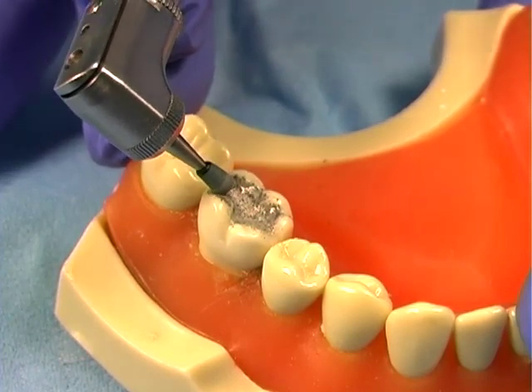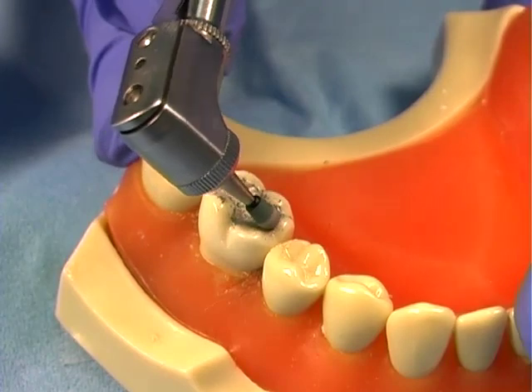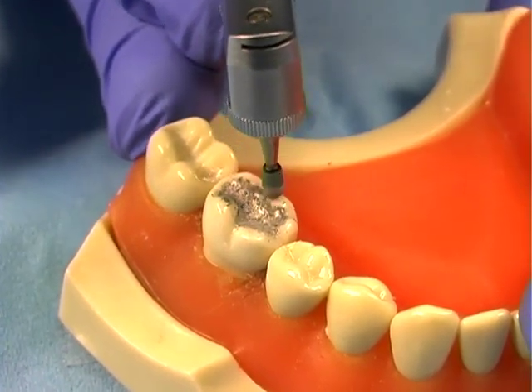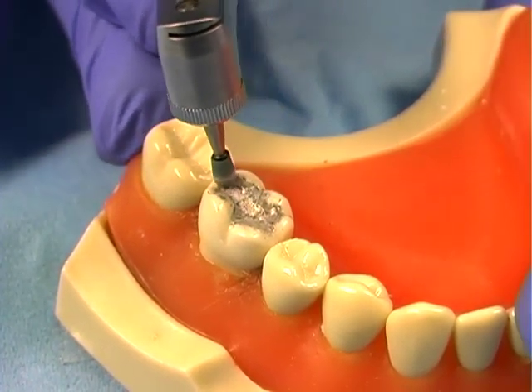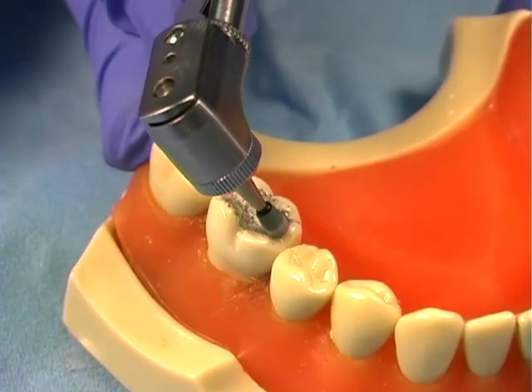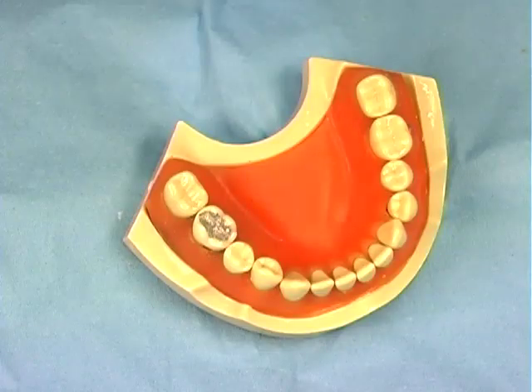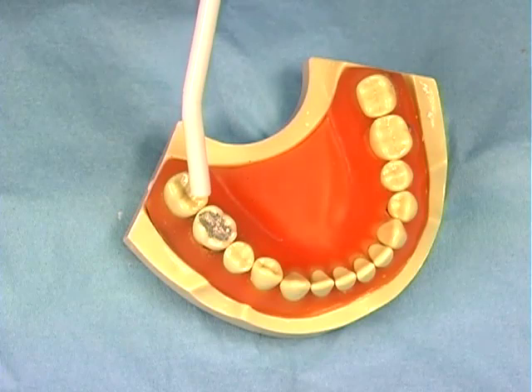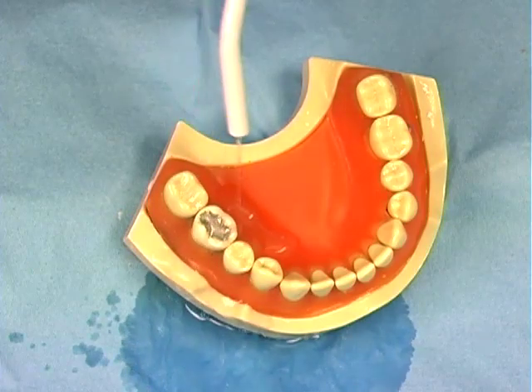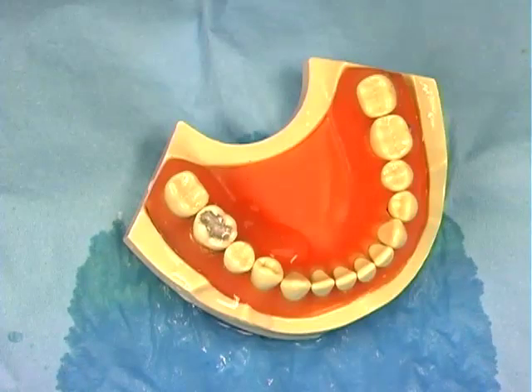Care must be taken not to put too much pressure on the amalgam because friction will cause heat buildup. The critical temperature for pulp damage is 140 degrees Fahrenheit. On a patient, rinse frequently with the air water syringe to cool and clean the surface. When using a typodont, use wet gauze.